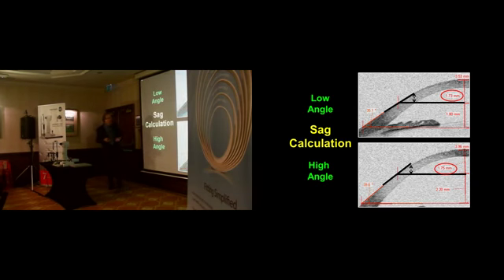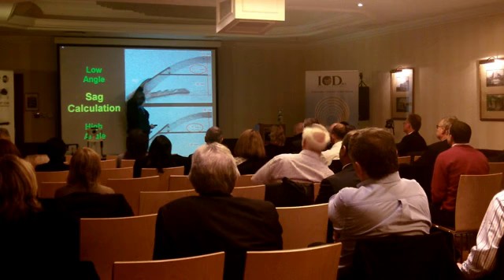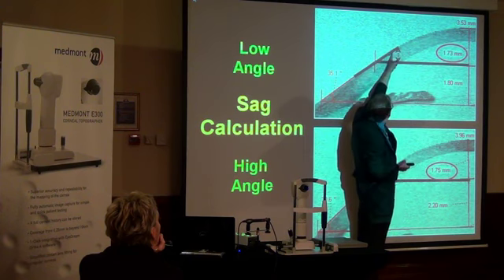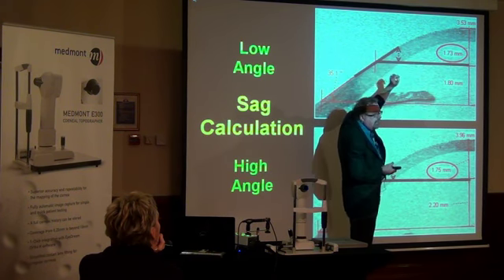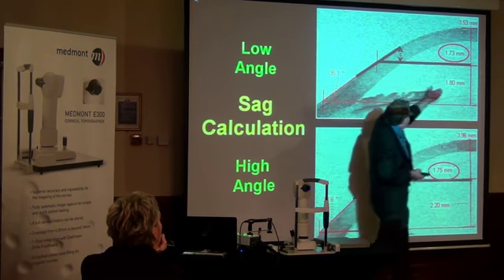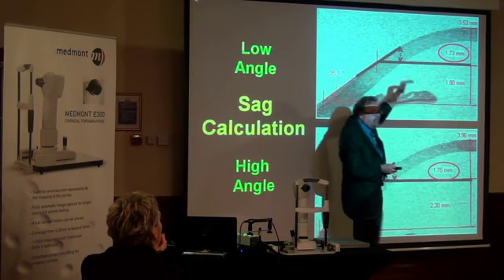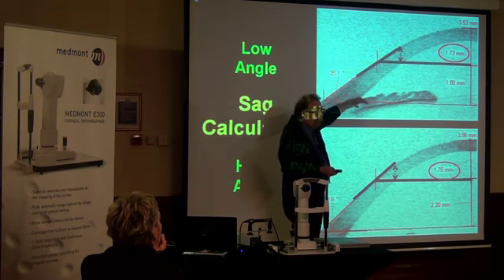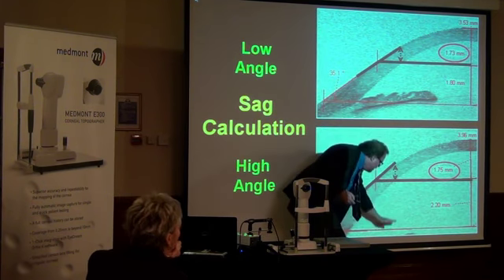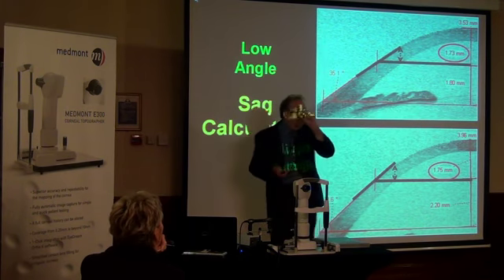Now, our data from our lab at Pacific University has shown us that as that angle narrows down at 10 millimeters, this angle that forms is a wonderful indicator of how high or low this area is, from 10 to 15 millimeters. The steeper that angle is, the higher that height is.